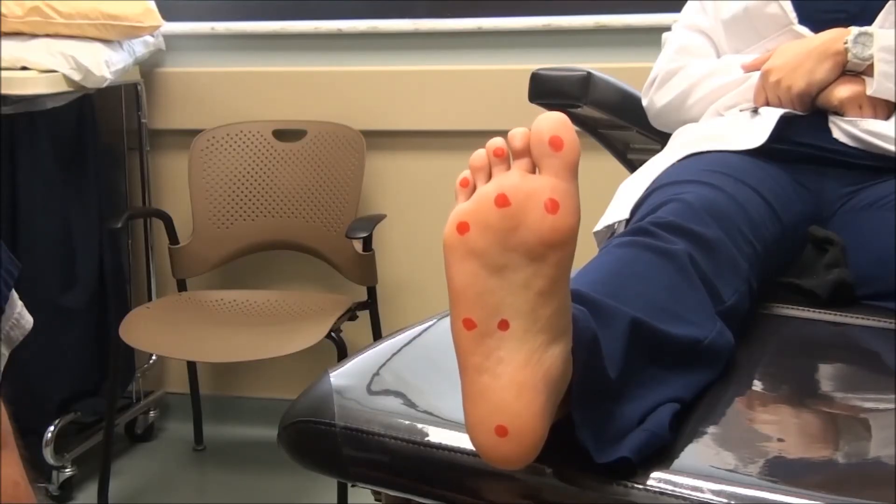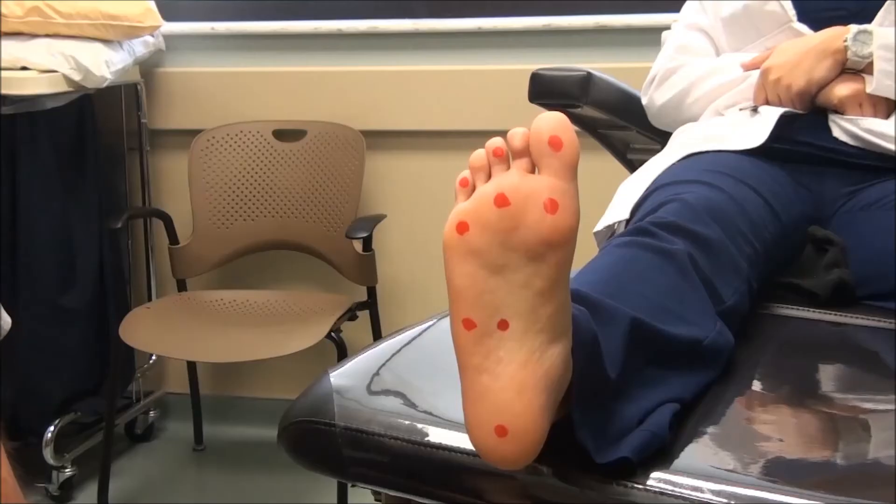As you see on the model here, there are ten positions that are demonstrated for ideal testing for the monofilament test. There are nine on the plantar surface of the foot and there is one on the dorsal surface of the foot at the web space between the first and second toes.